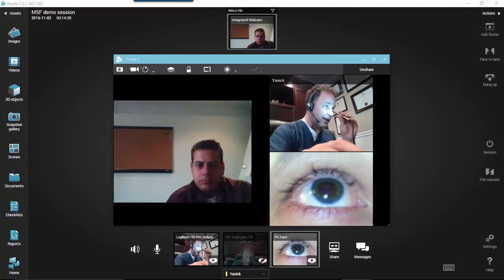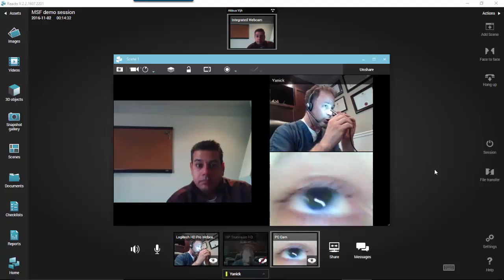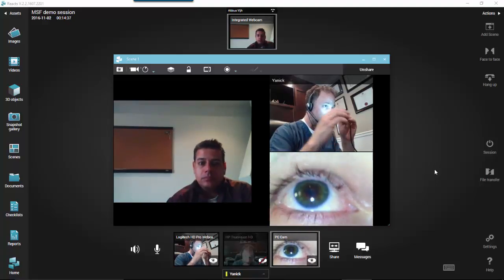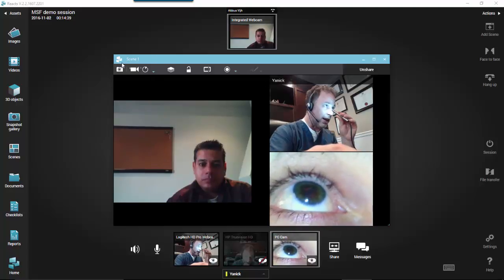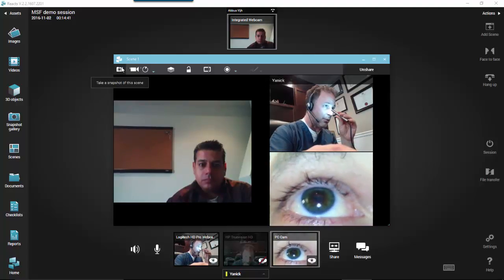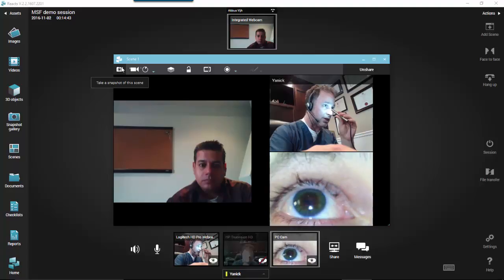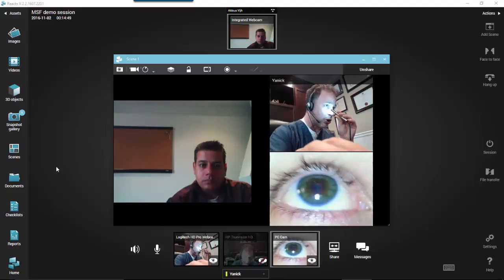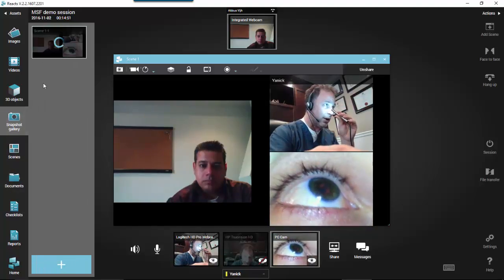So now, let's say Aldous would like to examine this. If he would be the expert at a distance, he could use the function here in the scene, which is that little camera. So I'm going to take a picture, take a snapshot. I just hit it, okay? And by doing this, either me or Aldous can take a snapshot. And the snapshot now is here. It's being encrypted in the snapshot gallery.